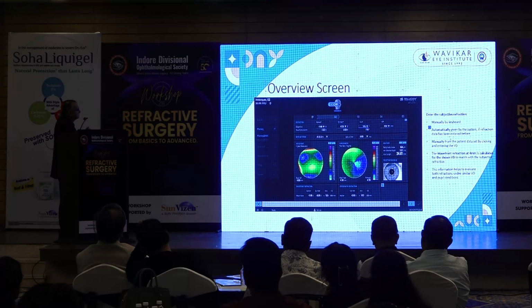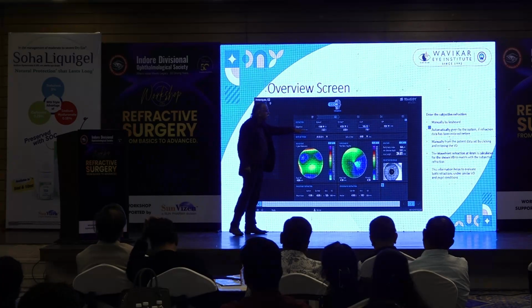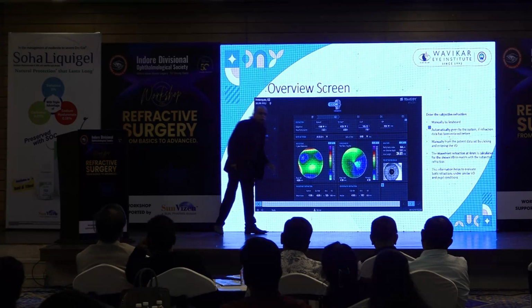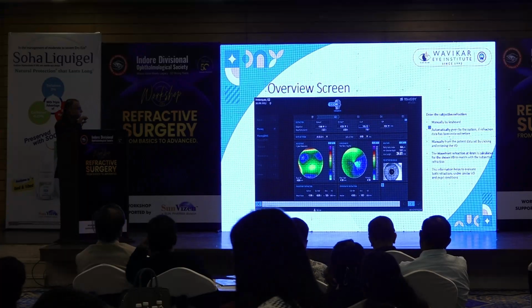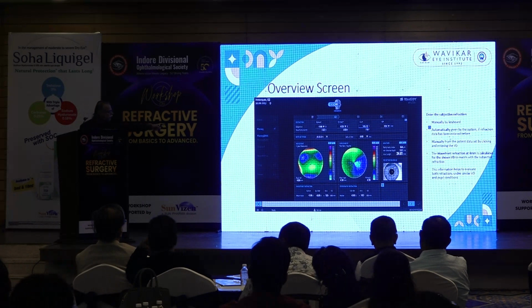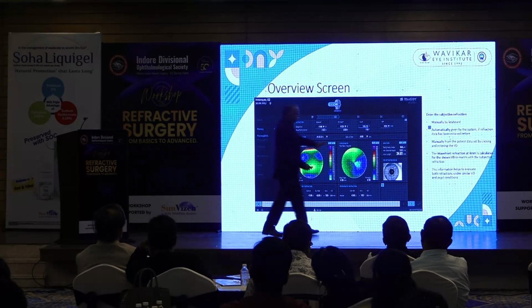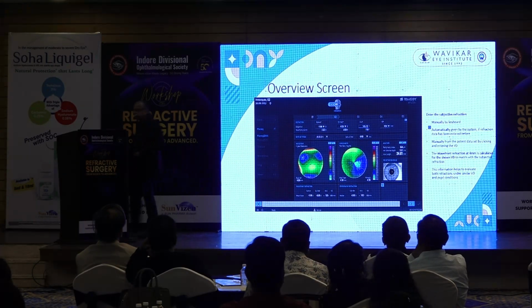The best part of this is that it is giving us wavefront refraction at 2 levels. Over here, it is giving you wavefront refraction at 4 millimeters, and over here, it is giving you at 6.5 millimeters. So if there is too much of a difference between the two, again, it's a red flag. Similarly, aberrometry, topography, and after that iris registration, and on the small window which is remaining over there, you see the anterior segment of the eye. That is the ACD and axial length also over there.